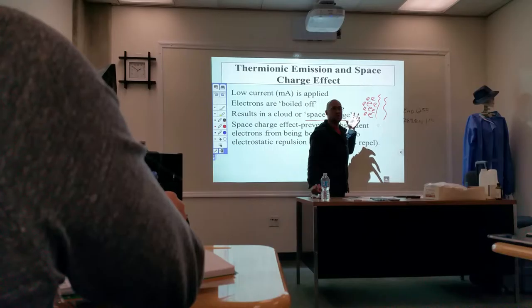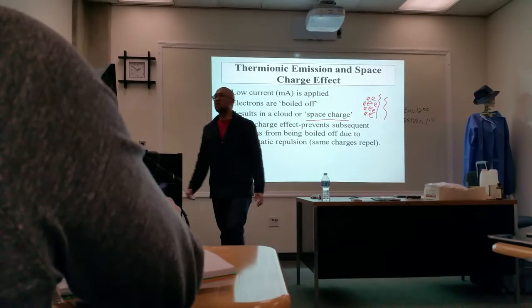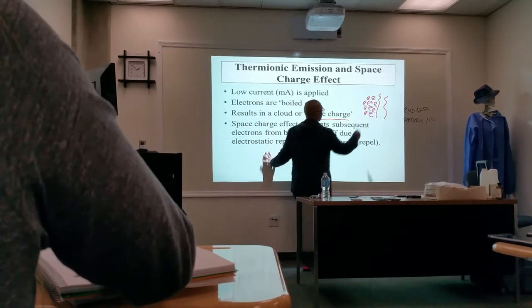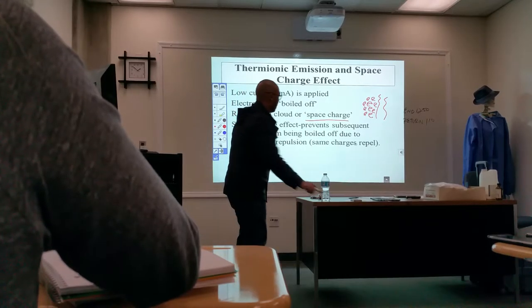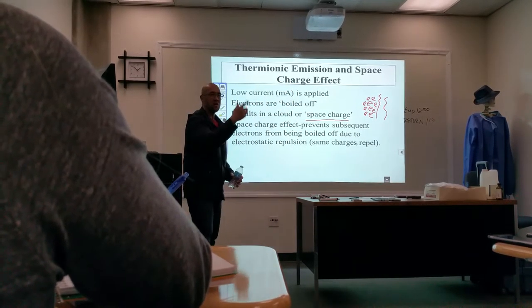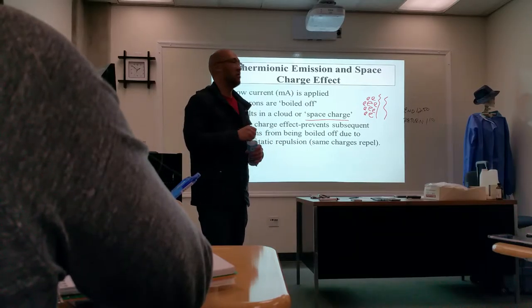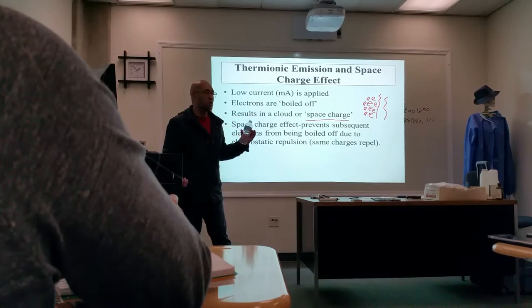This is known as the space charge effect. It prevents subsequent electrons from being boiled off due to the electrostatic repulsion of the larger group of electrons. It's kind of a safety feature. Not something that the technicians did with the equipment. It's a safety feature that is a natural occurrence. So that way you can't overproduce X-rays.